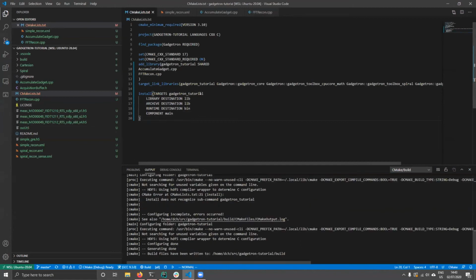But all Gadgetron needs to find this is that it needs to be somehow on the library path. You need to be able to link against this. So you can either do that by hard coding it into where Gadgetron is already storing its gadgets, but you can have it elsewhere. In this case, I would typically install to that local lib instead, so you can run things without sudo. I hope that answered your question.